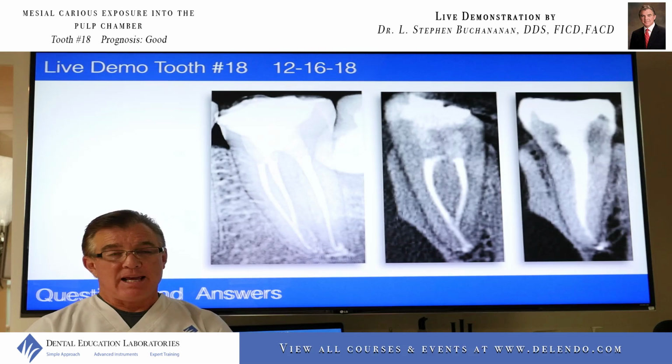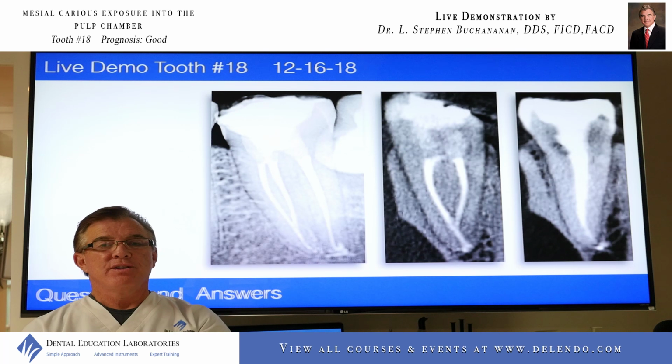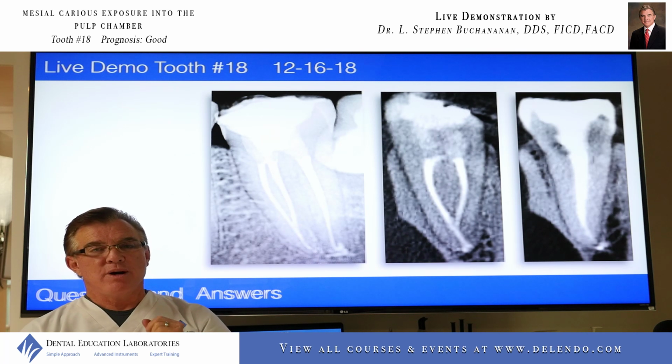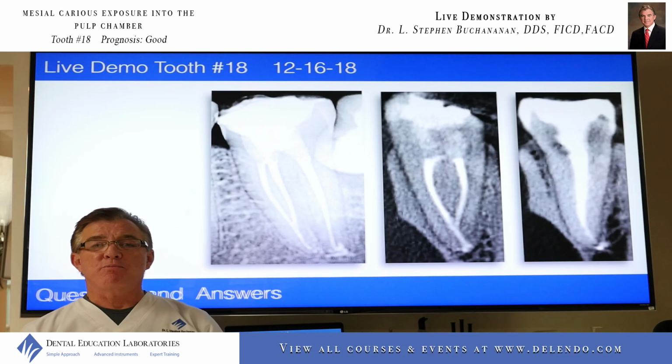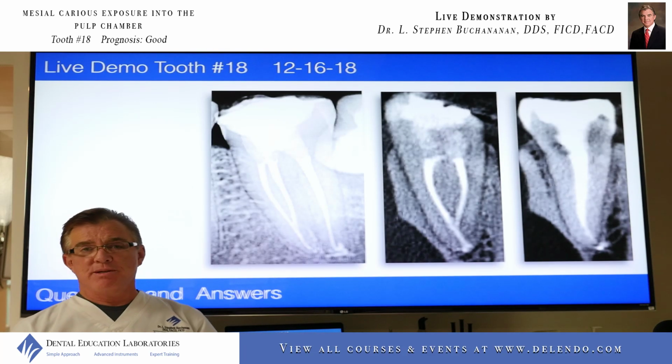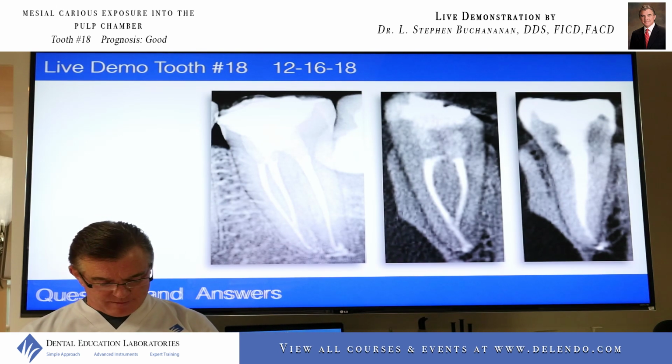But I was able to fit a 3004 in the distal. I was able to fit a 2004 in the 2 mesials. Remember, again, those were shaped with V-tapers. It was simply a 2006, 2004 V-taper.